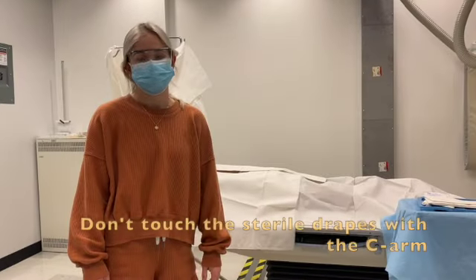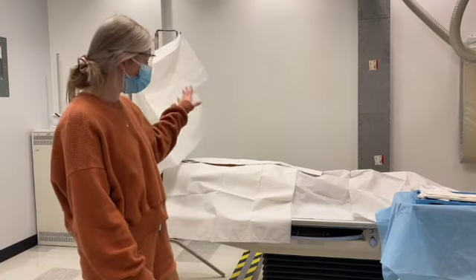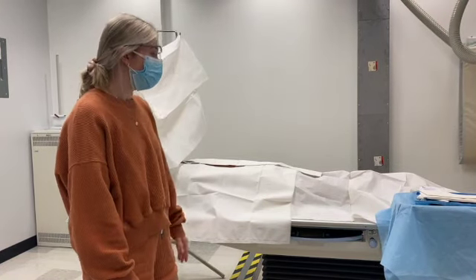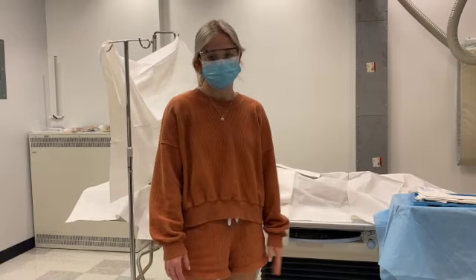The last thing to understand is that when you're moving the C-arm around the room, you want to be careful that you're not hitting the sterile drapes with the C-arm and that you're also not hitting the sterile tray with the C-arm.